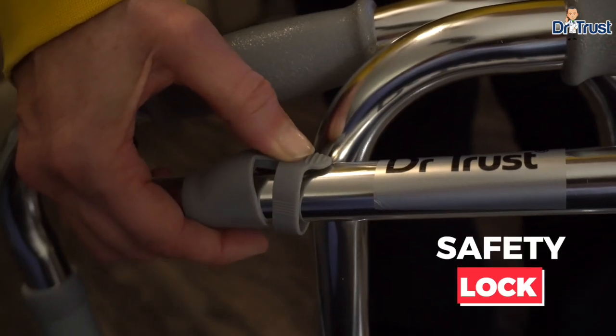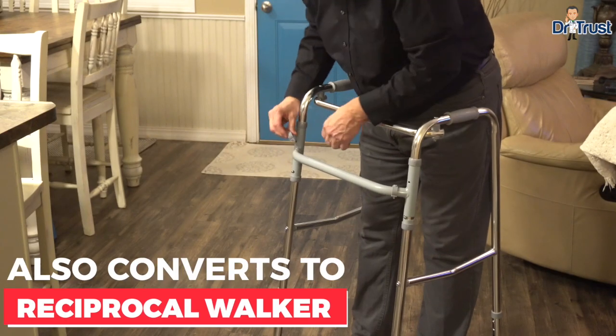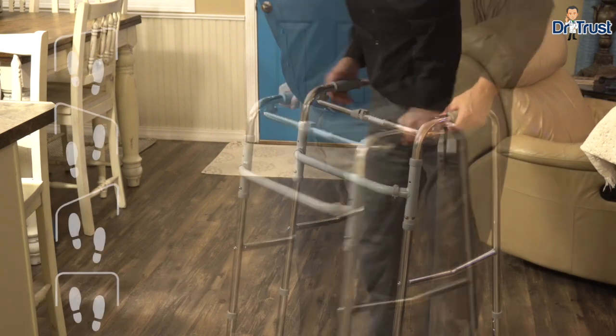Its push mechanism with safety lock allows the Walker to easily convert to a reciprocal Walker with a quick transfer of safety lock clips.